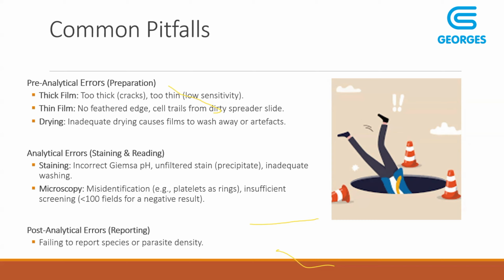Before we call it a day, it is good to always correlate both RDT and microscopy to ensure that a correct diagnosis is done.